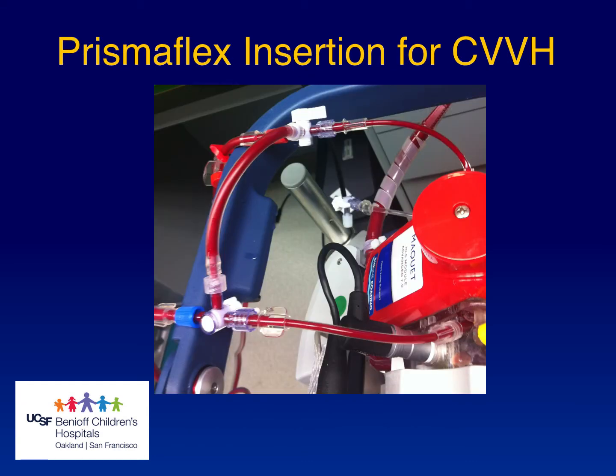Also, we have pigtails with stopcocks attached to the 3 luer ports on the CardioHelp. These 3 are the only access that we have in our circuit, and it is fairly common for us to attach the CVVH as seen in this picture.